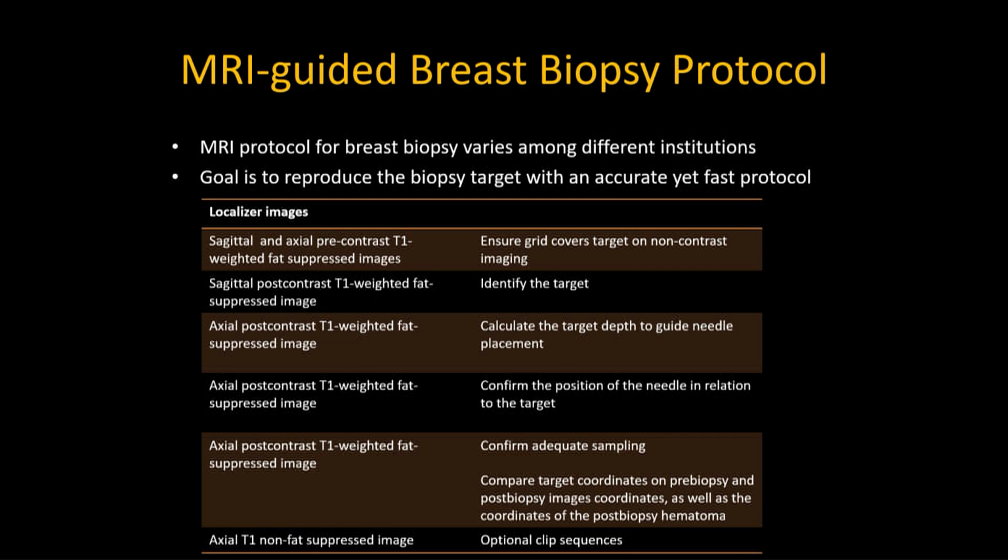I'm happy to share our protocol after this talk because it does vary from institution to institution. But the goal is to have a breast biopsy protocol where your target is reproducible, yet it's a fast protocol. So I'll quickly go over what we use.